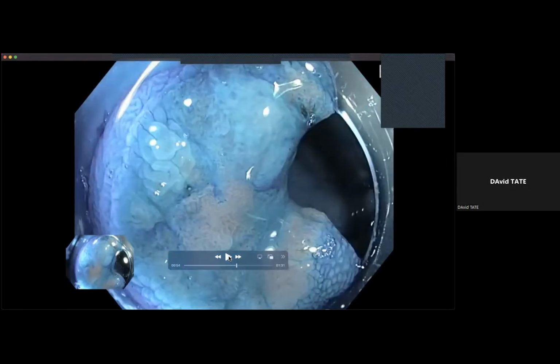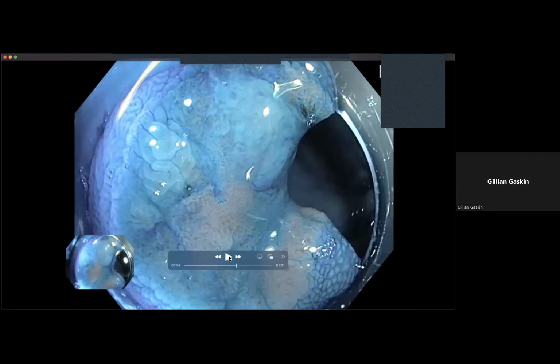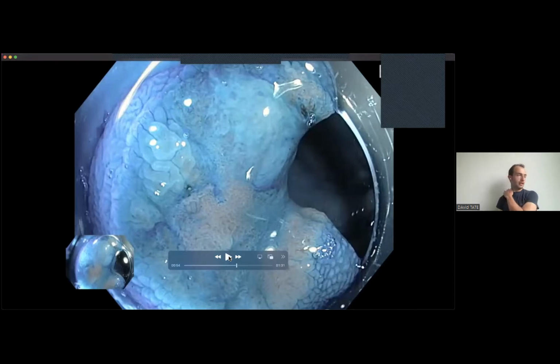Something's different about this one. We've put dye on it. Putting dye on it, for everybody else as well, allows you to see the actual pits. Gillian, you were a lot closer than me or Vikesh or anybody else to the days when you did histopathology and looked down a microscope. What you see here is the actual pits of the colon, and what you see with virtual chromoendoscopy is the vessels around the pits. But everybody talking about endoscopic images, it doesn't really matter. The structures are the same. Anyway, here you will see it in the traditional way of putting dye on the polyp.